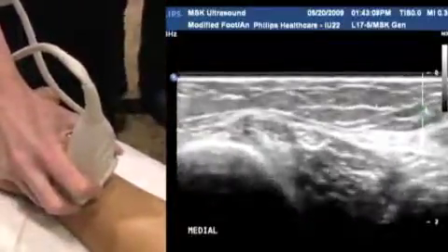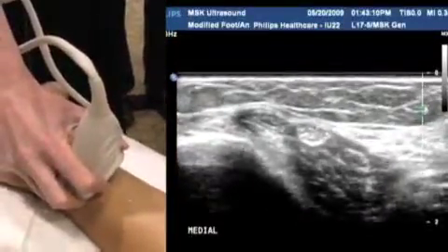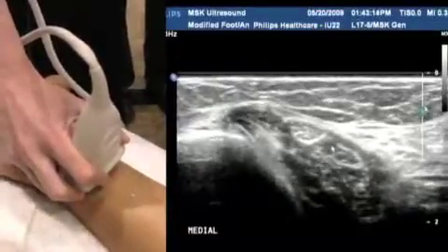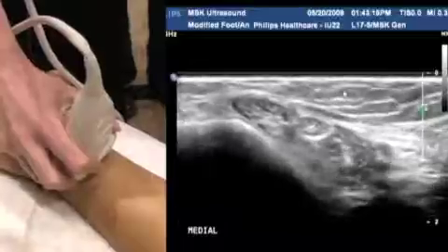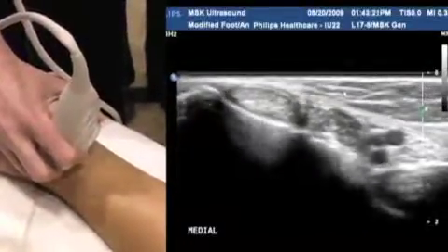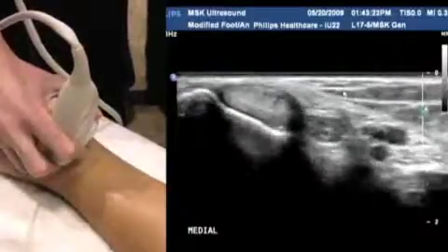So heading back now proximally in the tendon complex. You see here flexor digitorum longus with its muscle at the back. We're going to do exactly the same thing. We're going to start proximally, and we're going to follow that tendon distally. Heel toeing all the way, making sure it stays nice and echogenic.